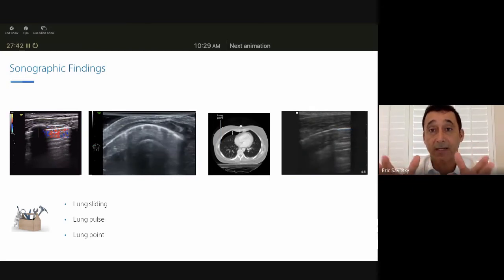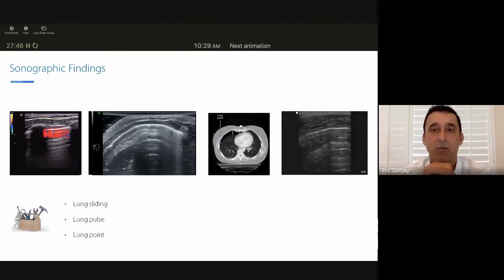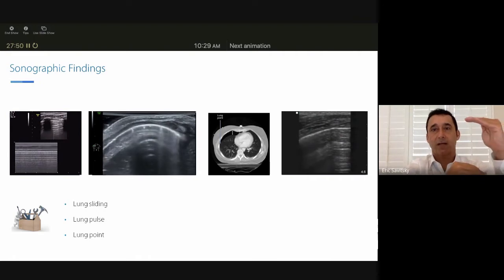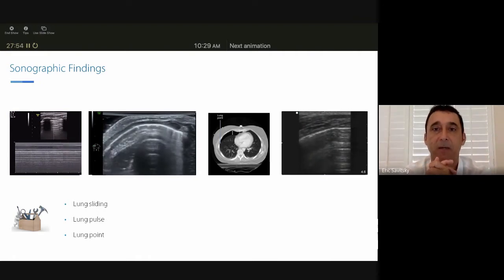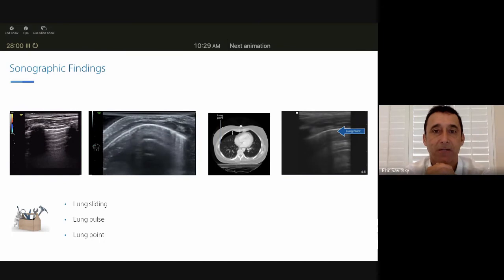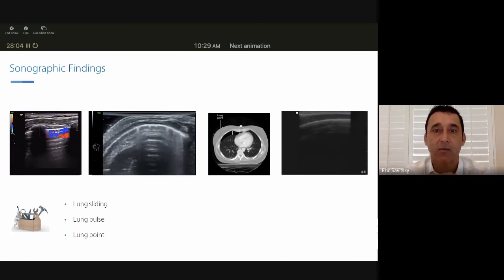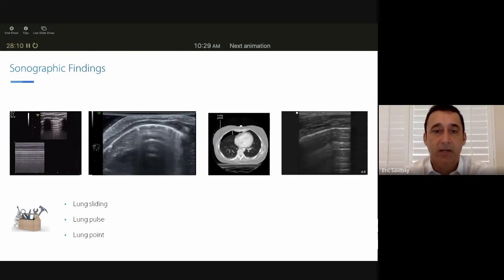What you've done there is you've identified the location, the height of the pneumothorax, where you have lung sliding with no pneumothorax, and then you have the loculated air with no lung sliding because the air is blocking signal transmission. That represents the junction of the pneumothorax, and it's a very, very specific sign that does represent a pneumothorax with a high degree of accuracy.